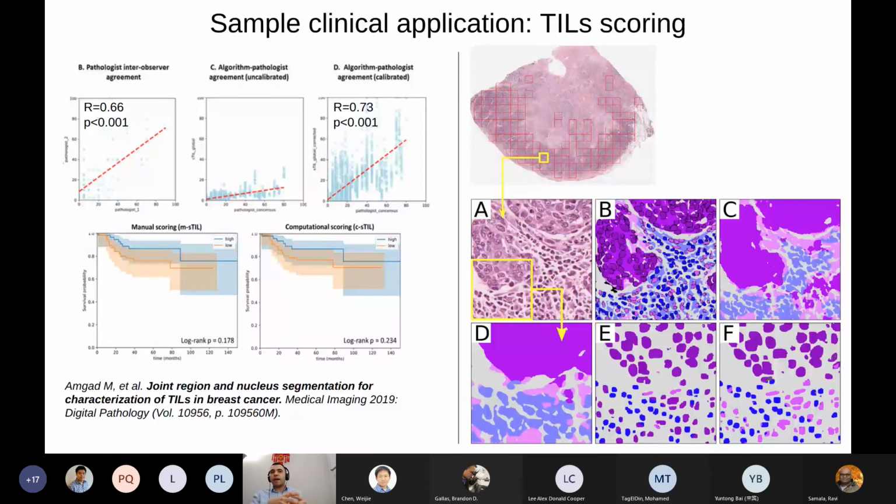Basically, they have a big set of slides that they've collected from multiple institutions in different places around the world, and corresponding scores from pathologists, including Dr. Roberto himself, but others. I'm not sure how many, but I think it's 10 plus pathologists per slide, if I'm not mistaken.